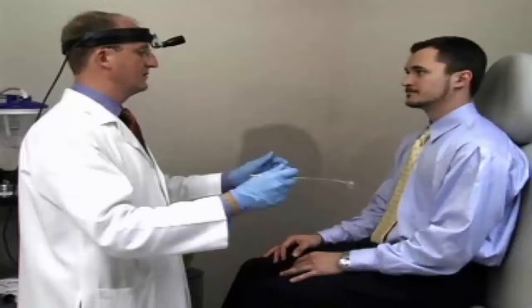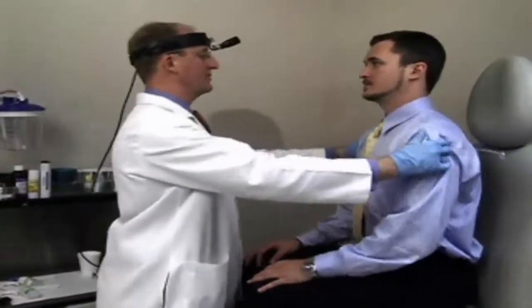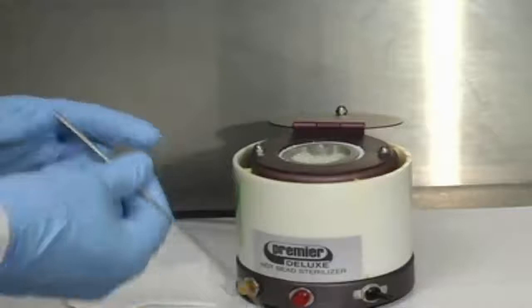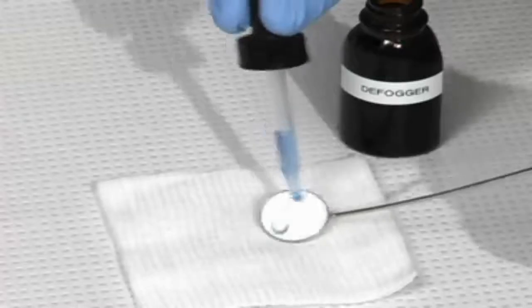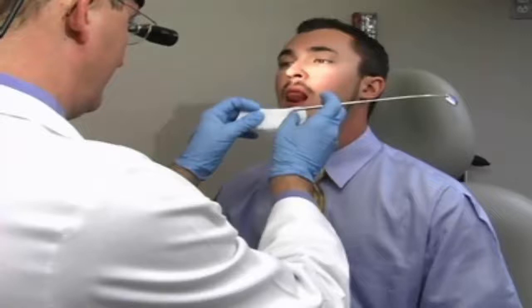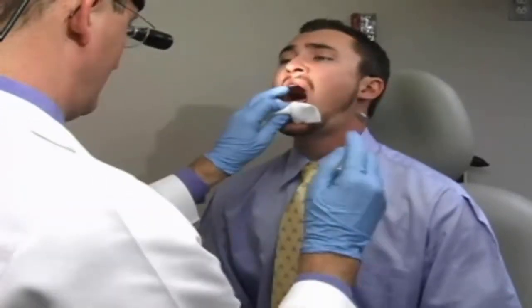The patient should be seated opposite the examiner. Ask the patient to uncross his or her legs and lean gently forward. Ask the patient then to open the mouth widely and protrude the tongue. Warm the mirror to just above body temperature or coat the mirror with an anti-fogging solution. Next, gently grab the patient's anterior tongue with a sterile 4x4 cotton gauze pad. Ask the patient to take slow, deep breaths through the mouth.